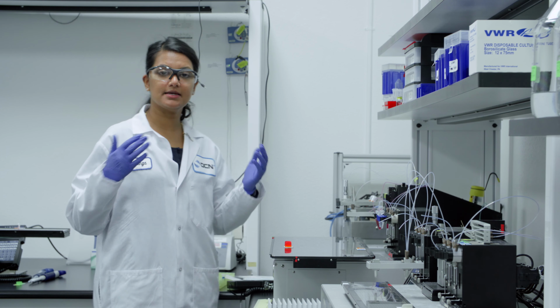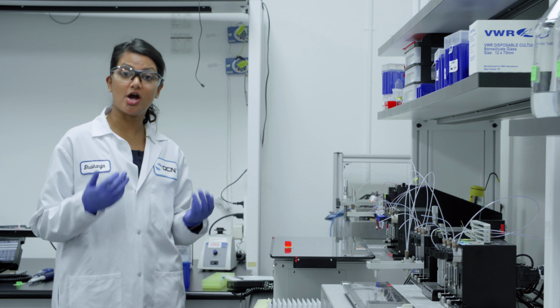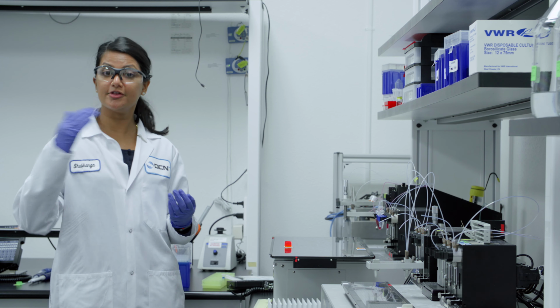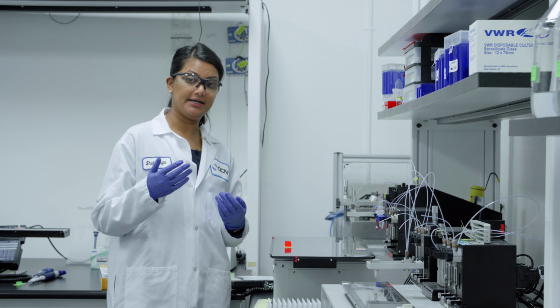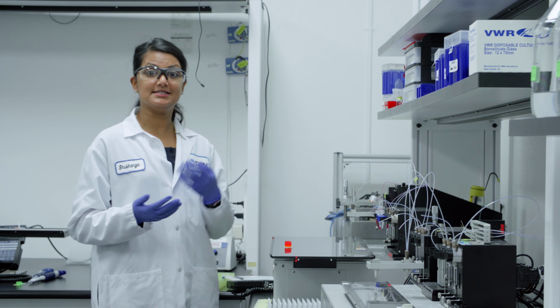And then the second major aspect of your lateral flow strip is the conjugate. So what is the conjugate? The conjugate is your other antibody that would detect your antigen and form a sandwich. But on that antibody, we'll have a visual particle so that we can see it.